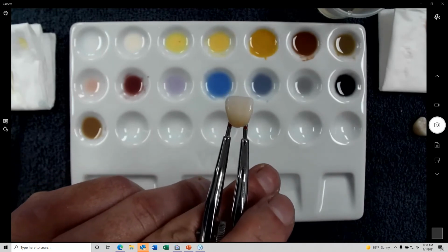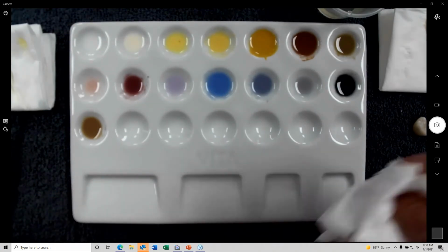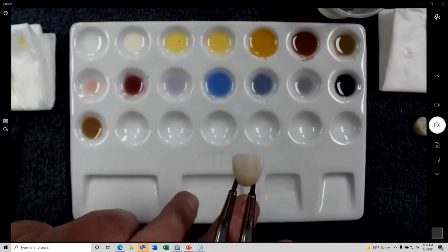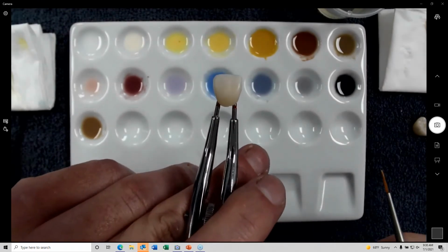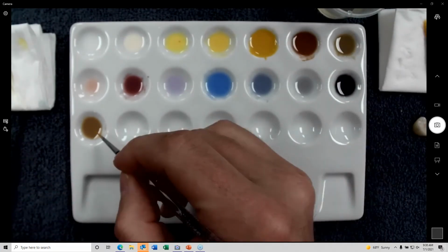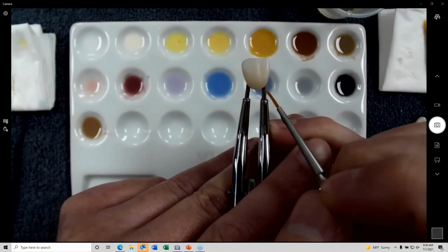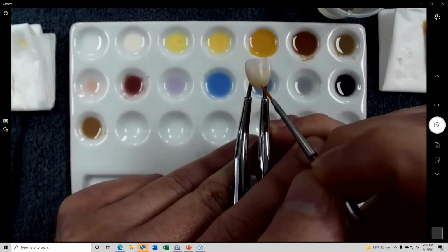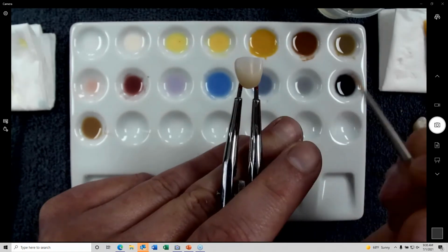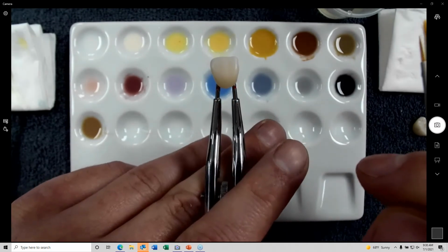Now, if we're going to try and use this fluoro glaze, we want to spray it on at the end. So there's a couple of ways that we can do this. We can do the two-stage method of adding some of the chroma or effect directly to the crown, and then doing a stain fixation bake.